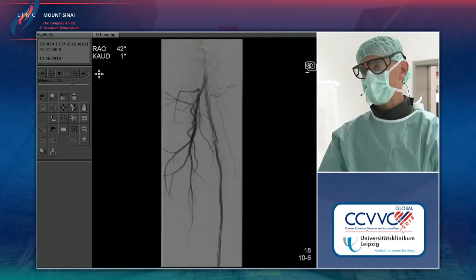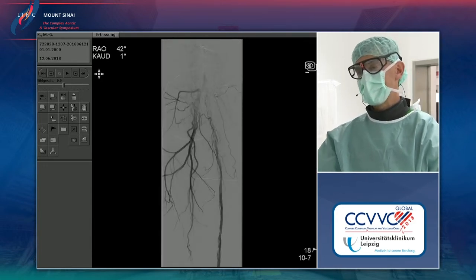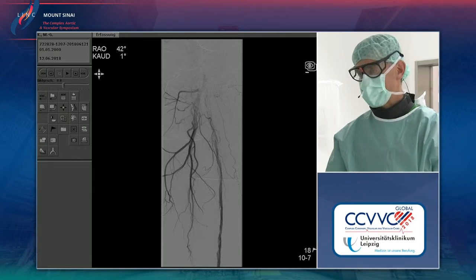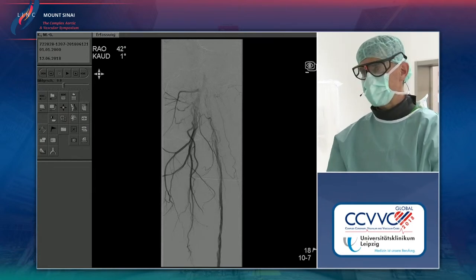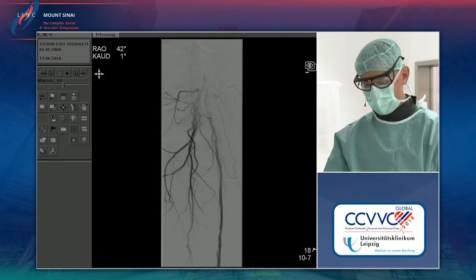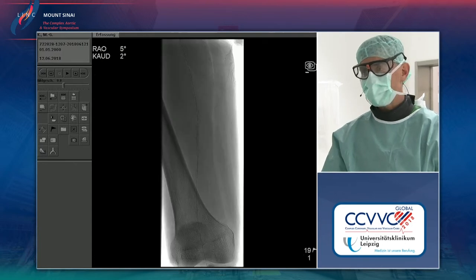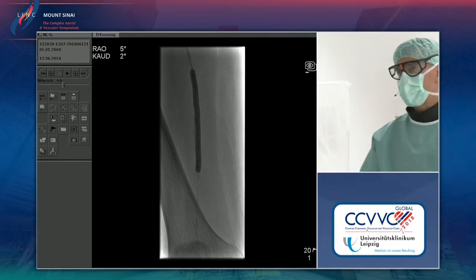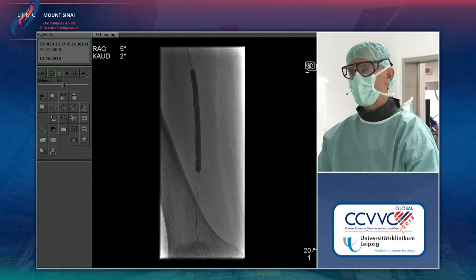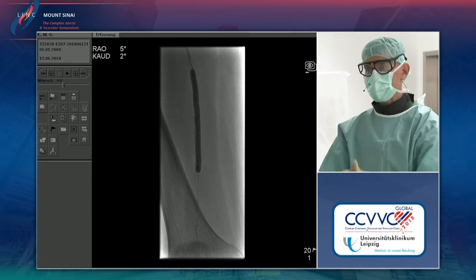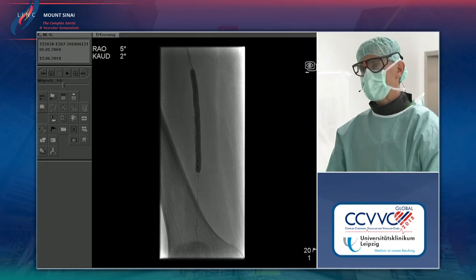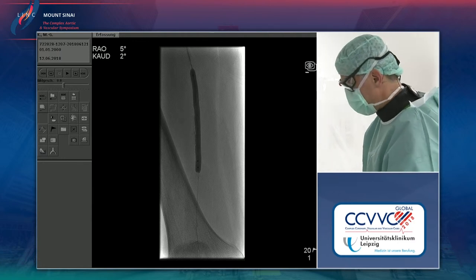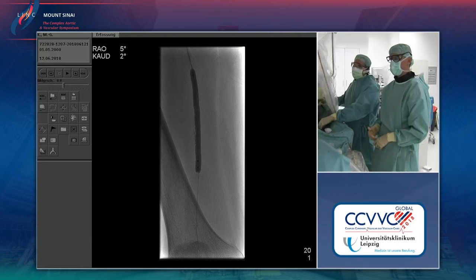The result so far is very clear — this needs stents over the whole length. Distally at the calcium we plan to take a Supera stent. Proximally without calcium, potentially a drug-eluting stent. We continued with an ultra-score scoring balloon — the new one with two wires outside — a 6 by 60 balloon, and we are now prepared to take a 5.5 Supera stent in.